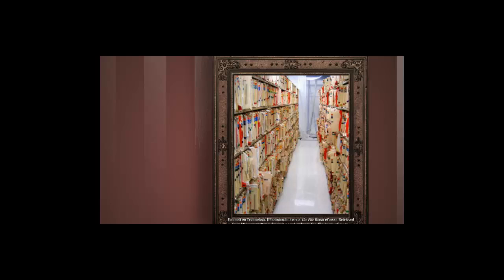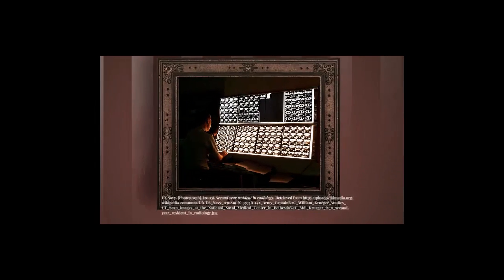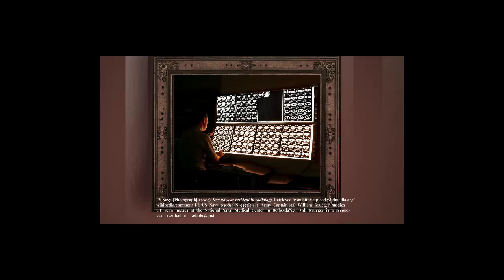I was a regular x-ray tech. They started to come up with CR imaging. So regular x-ray tech, when I say that, I was doing film days. You had to go in a dark room and develop the film, right? You had some daylight processors where you could send images from CT and MRI, which are hundreds and hundreds of images. They would print out, say, 20 on what's called daylight film, which you could handle without exposing it when you brought it to light.